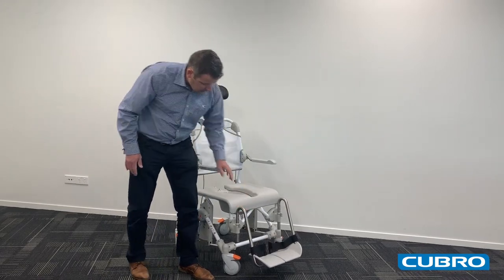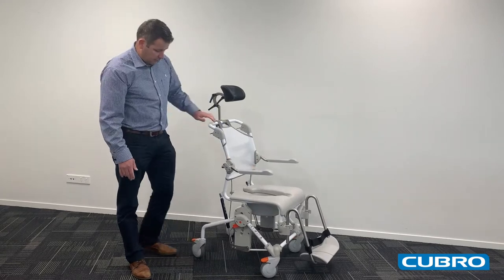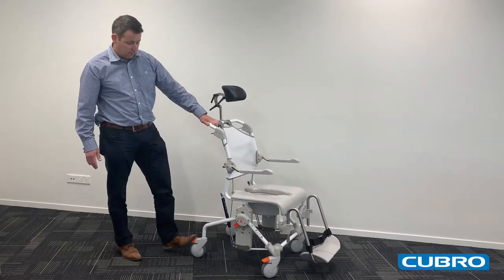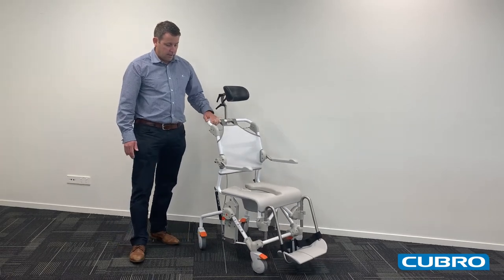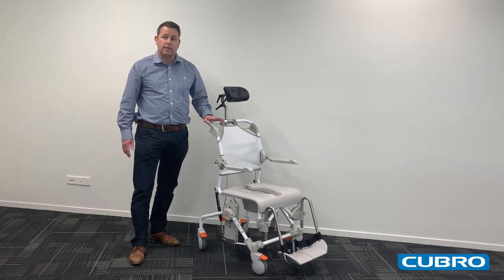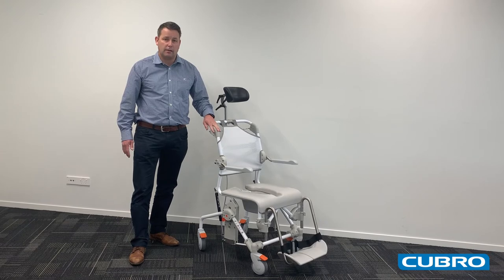The casters are large swiveling casters, each one individually braked. The chair has a 160kg safe working load and comes with a 5 year warranty.